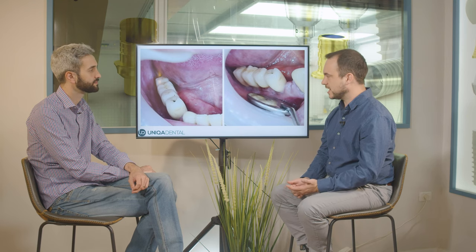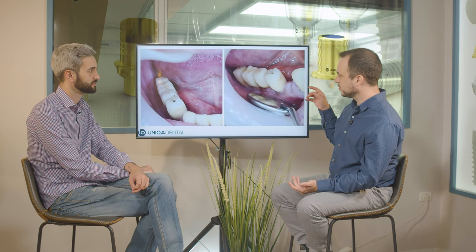You don't need another implant. So what we decided for this case is instead of making a restoration for this tooth with the addition of an implant or a single crown, we'll use the four implants that the patient already has and just change the bridge and add another cantilever tooth to the same bridge.